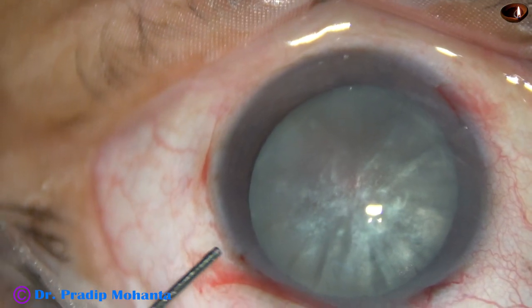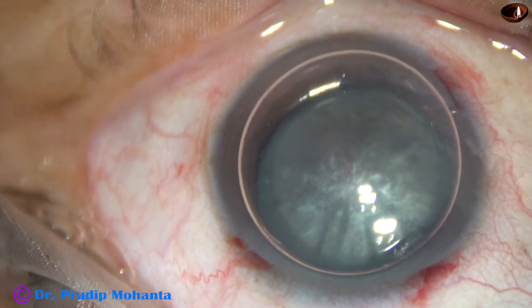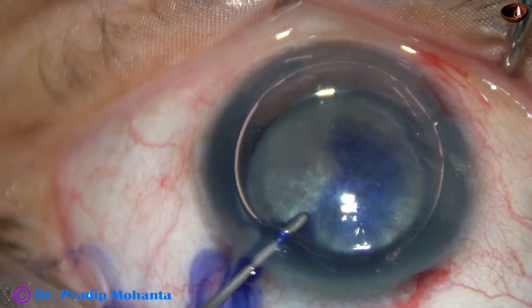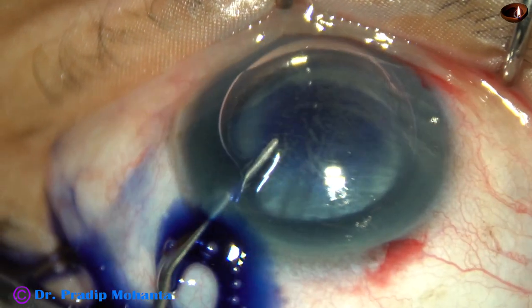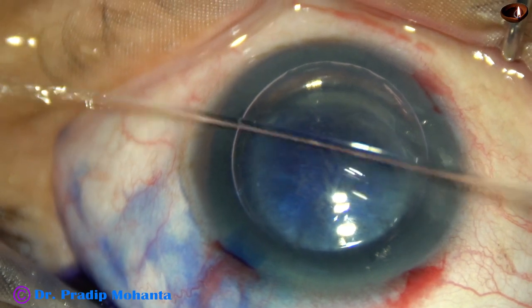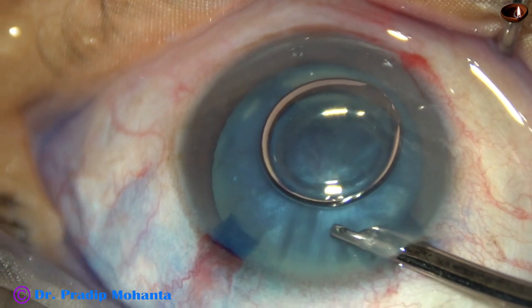An air bubble is injected into the anterior chamber. Beneath this air bubble, trypan blue 0.06% dye is applied over the anterior capsule of this white cataract. After 10 seconds, the dye is washed out with BSS.